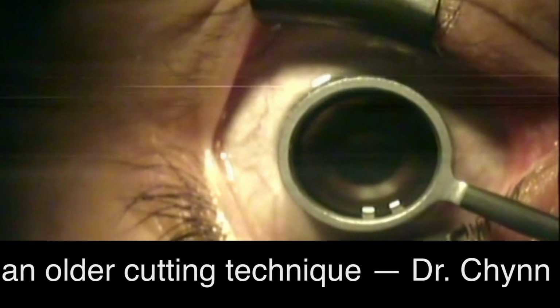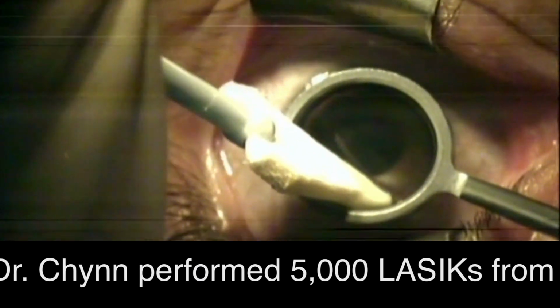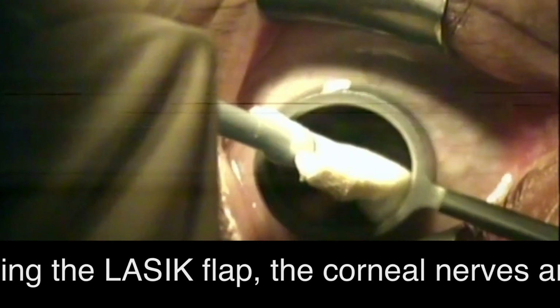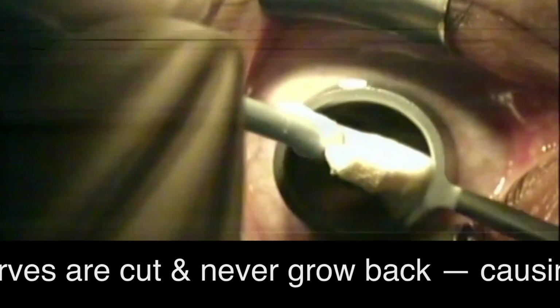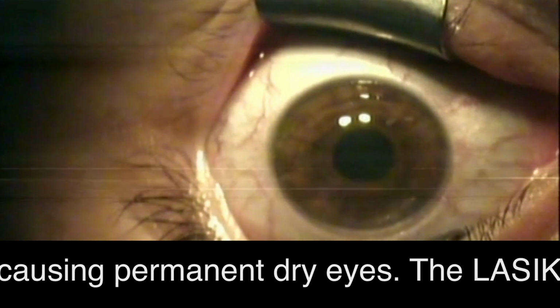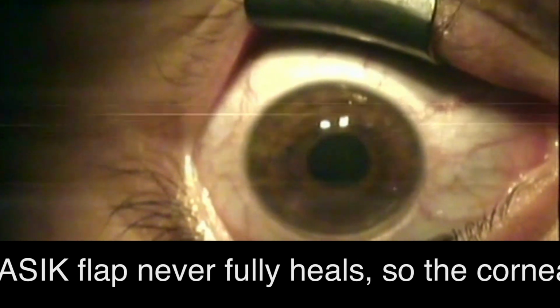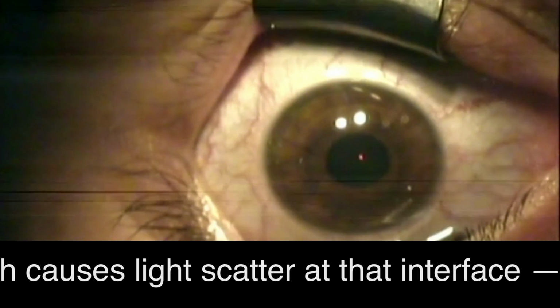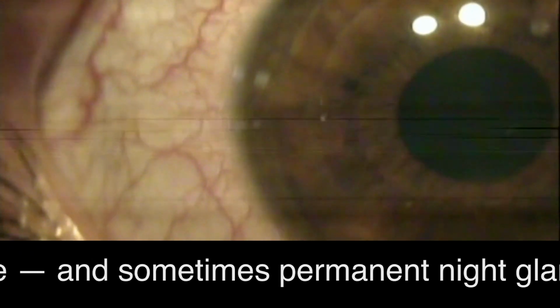So this is the dilute alcohol solution. It's inside this well, the metal ring that you see. And this is just a little sponge that we're using to soak it up. I'm trephining now, so I'm just rotating the edge of the ring to get a little edge. Then I'm using some BSS balanced salt solution to irrigate away excess alcohol. It's a little bit toxic for the eye.